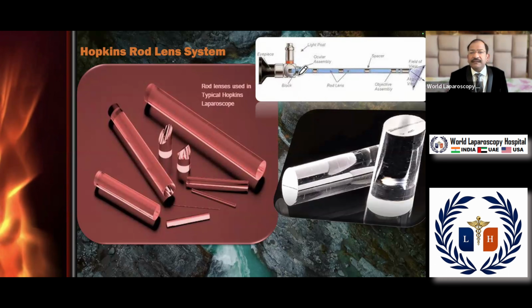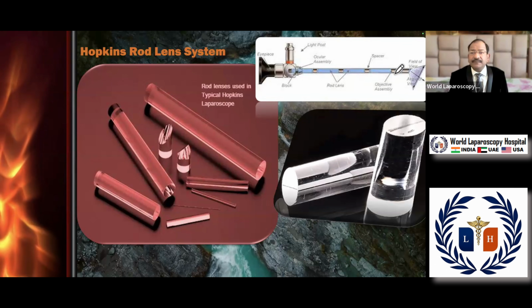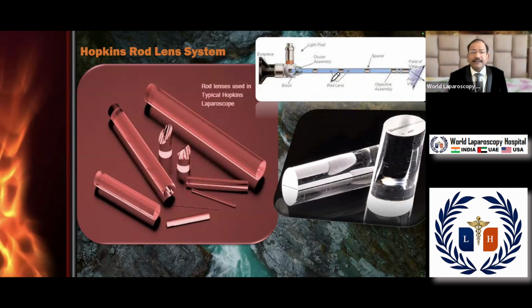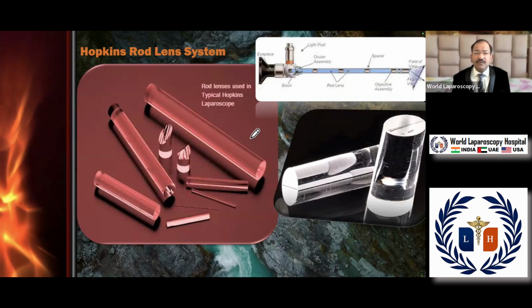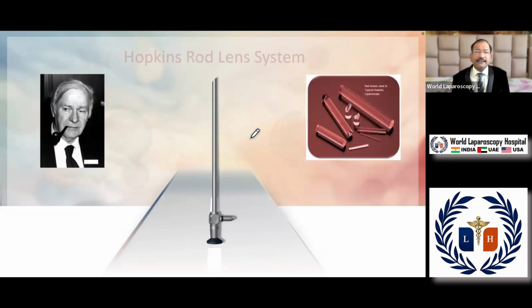These rod lenses are very important because they are basically prisms, and the light from one end is transferred to the other end with the help of these rod lenses. So this is how Hopkins invented it, and today we are using it for minimal access surgery.